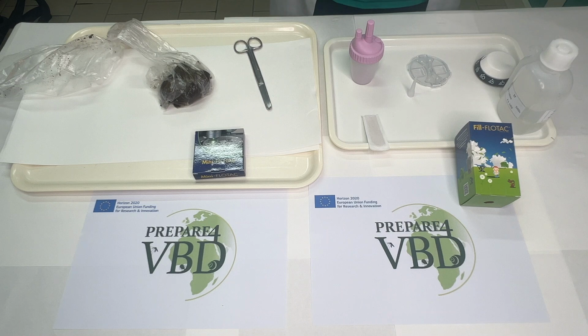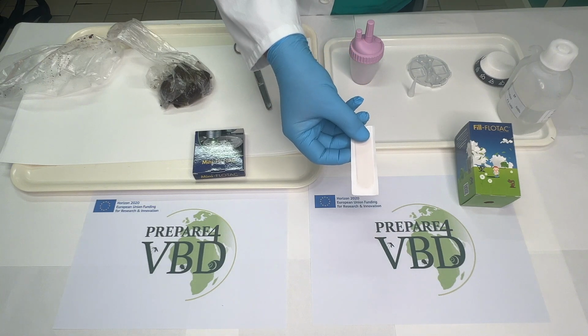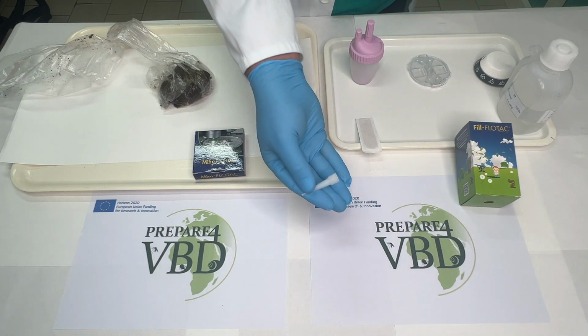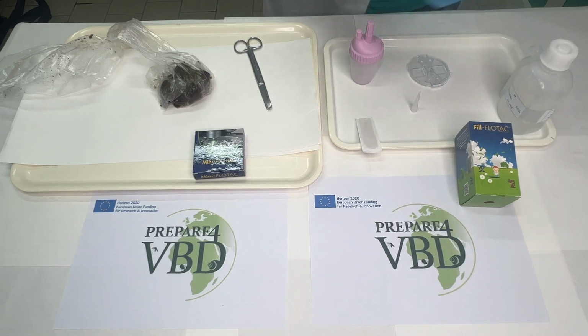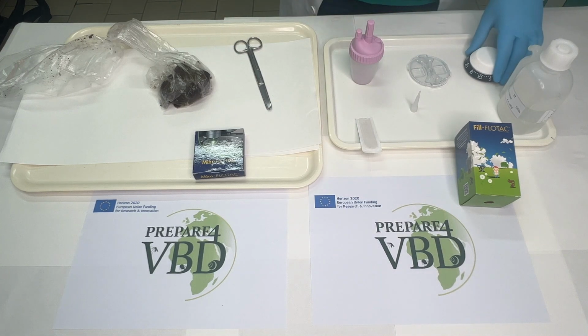And then we will need the wooden spatula to homogenize the sample, the tip for the Fill-FLOTAC in order to fill the chambers, and the timer because we are going to wait 10 minutes and then translate and analyze at the microscope.